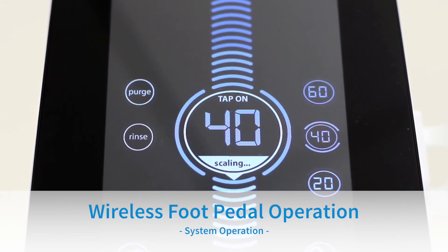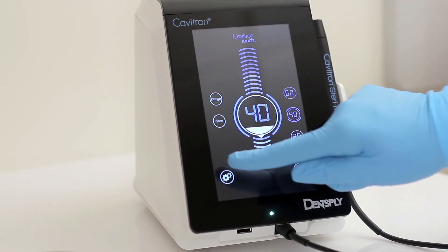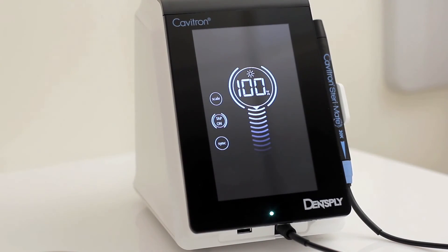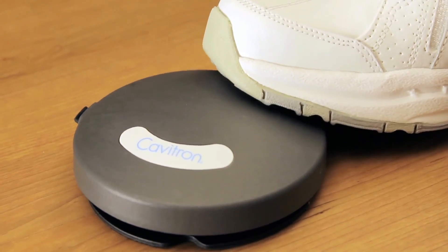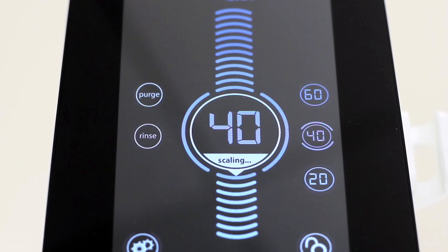Tap-on Wireless Rechargeable Foot Pedal Operation: This feature eliminates the need to hold down or pump the foot pedal, adding comfort to your routine. Enter the settings screen to enable or disable tap-on. When parentheses are shown around the tap-on icon, tap-on is activated. If there are no parentheses visible, tap-on is deactivated and the icon will be grayed out. With tap-on activated, tapping on the foot pedal once will activate ultrasonic power for approximately 4 minutes. Tapping the foot pedal a second time will disable ultrasonic power and water flow. On the main scaling screen, a tap-on indicator will appear in the power level bubble while scaling.